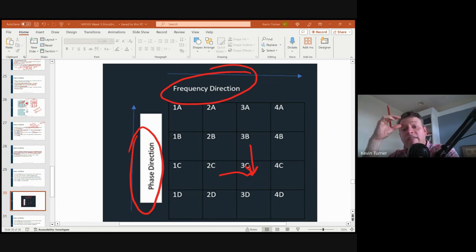Yeah, so Jordan, a lot of these parameters are set. Here's why parameters are important, because guess what? Patients aren't all the same. You copy it from one sequence to the next. You run a shoulder, fine. You don't change anything. Run the next shoulder, nothing changes. Suddenly you get a linebacker, somebody whose shoulders are gargantuan, and suddenly your parameters don't fit that patient anymore, right?